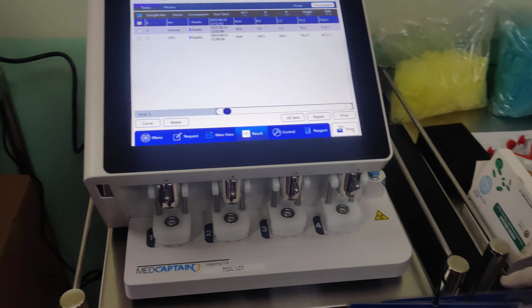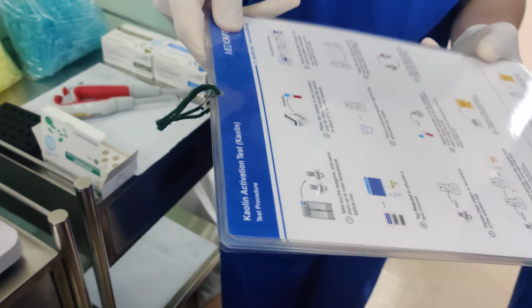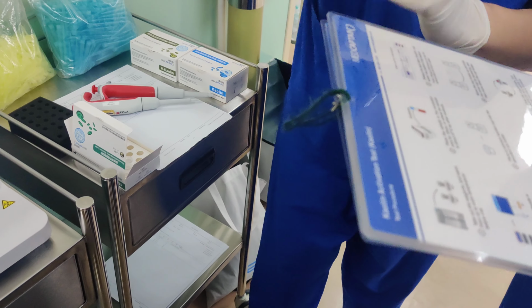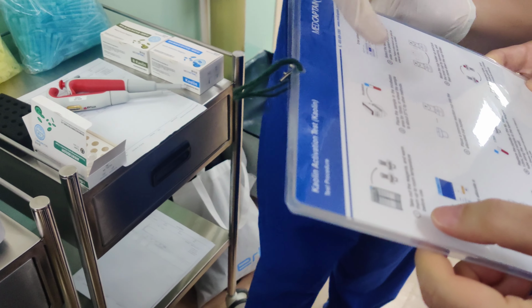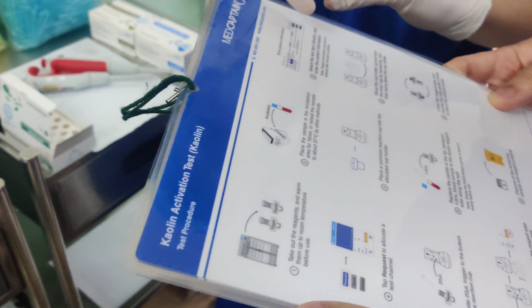Okay, so how to run the test? Actually, the guideline is all here. So kindly hold on to this, then I will guide you on each step, okay? So we are at this step, right? We put in the incubator, right? So next up, request the test.